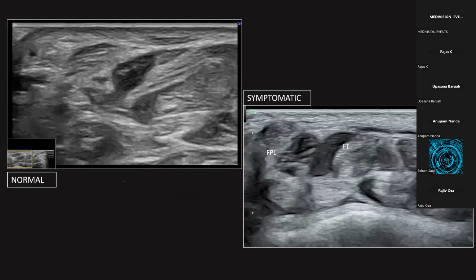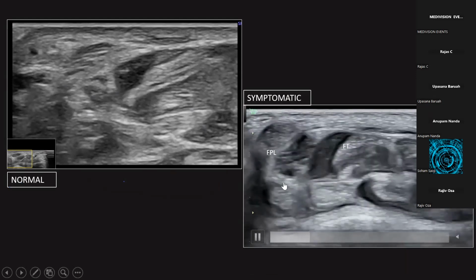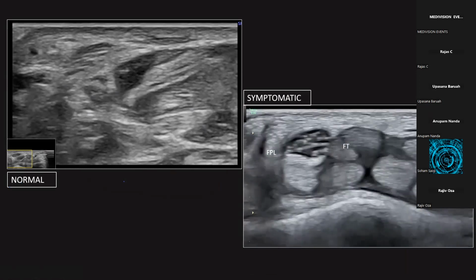Sorry, please continue. Okay. Then it's going in again and falls into the narrow space between the bursa. But in this case, this is a symptomatic case. We can say it's just lost. It's just fallen into a trap in between the bursa. It fails to move out.